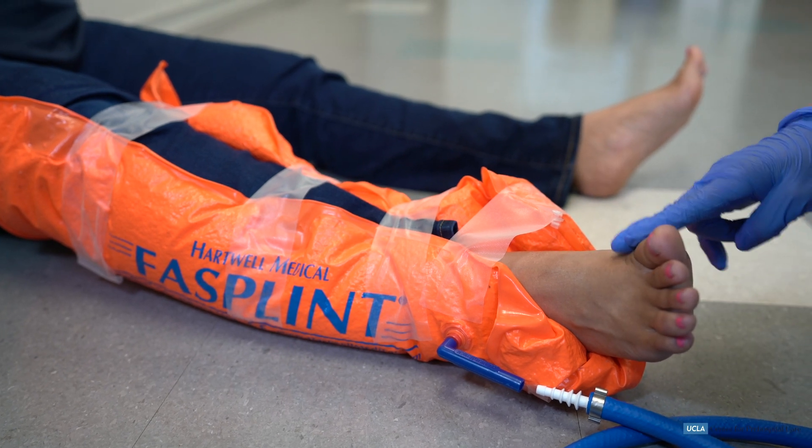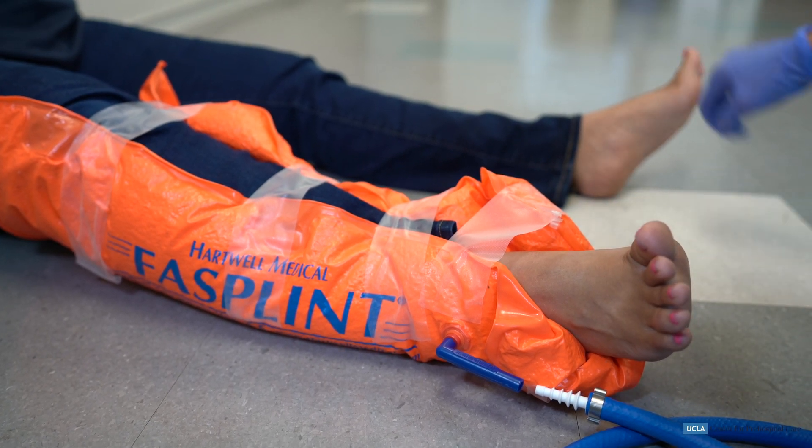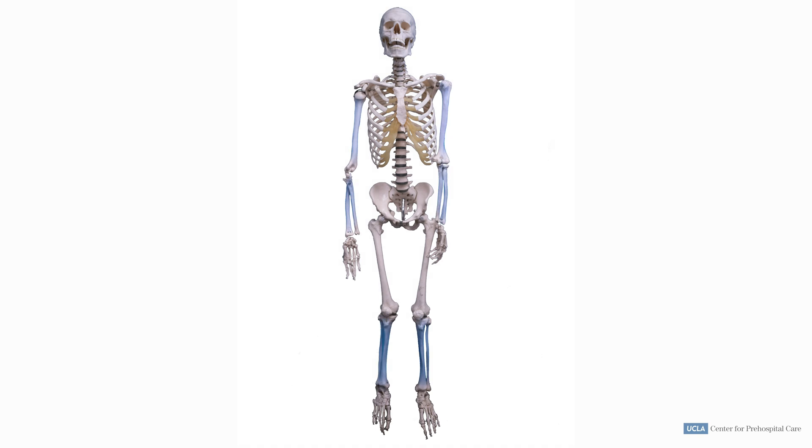Now that you have seen the skill completed properly, let's walk through the steps. Here we have highlighted in blue some of the long bones an EMT may have to immobilize.